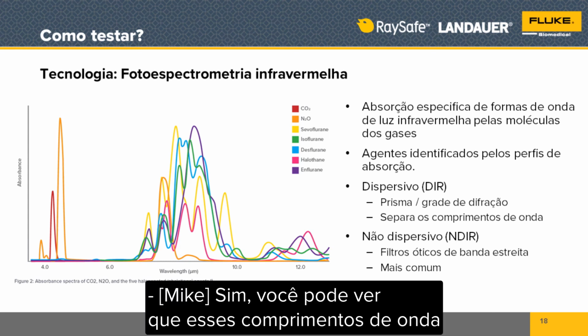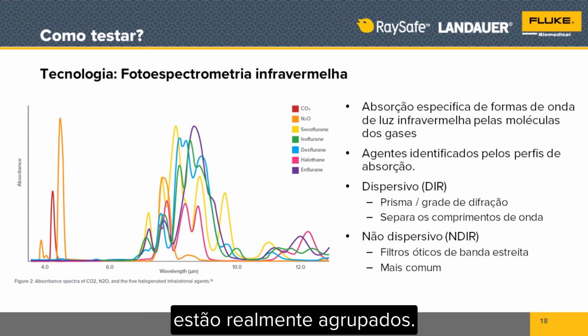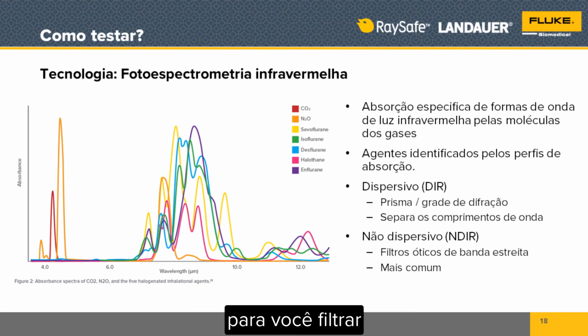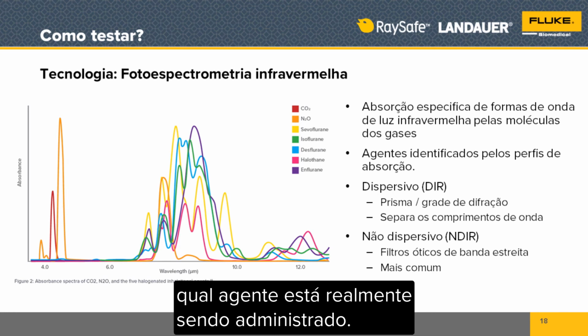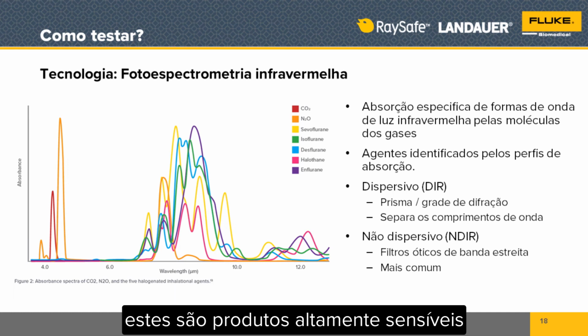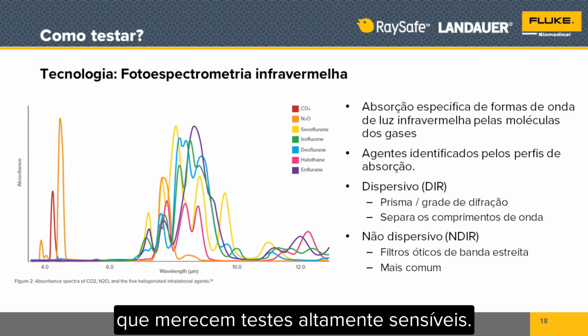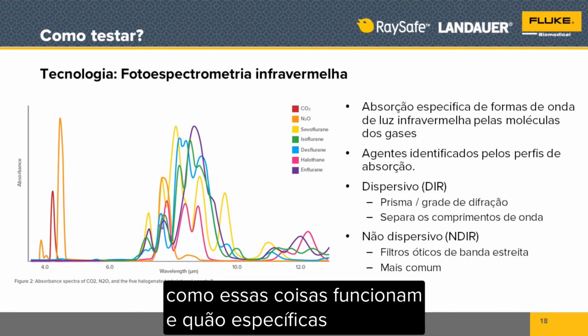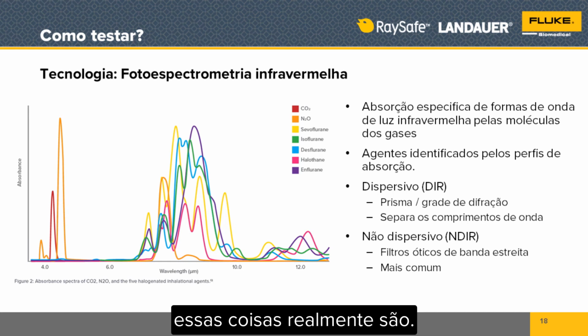Yeah, and you can see that these wavelengths are really bunched together. So these sensors are really sensitive to be able to filter out which agent is truly being administered. If you think about that, these are highly sensitive products that deserve highly sensitive testing. So it's good to know how these things operate and how specific they really are.